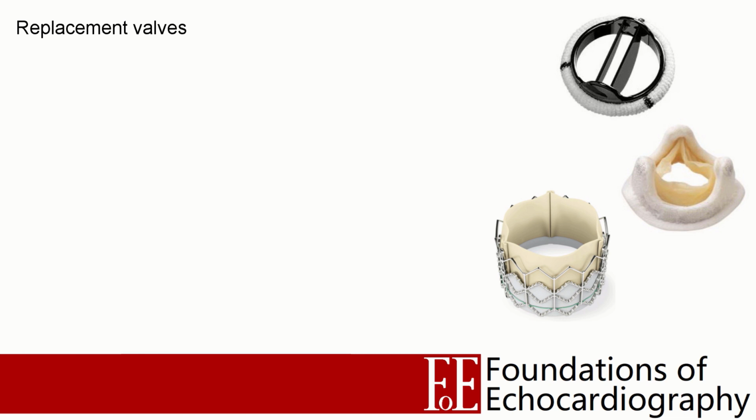For the level 1 sonographer, the key questions when facing a replacement heart valve are exactly the same questions you ask when thinking about a native valve. So does it open? Does it allow blood through? And when it closes, is there any incompetence, any regurgitation? If there is regurgitation, does it occur through the valve, i.e. transvalvular, or around the sewing ring, i.e. paravalvular? Knowing how challenging it is, you should have a low threshold for seeking a second opinion.